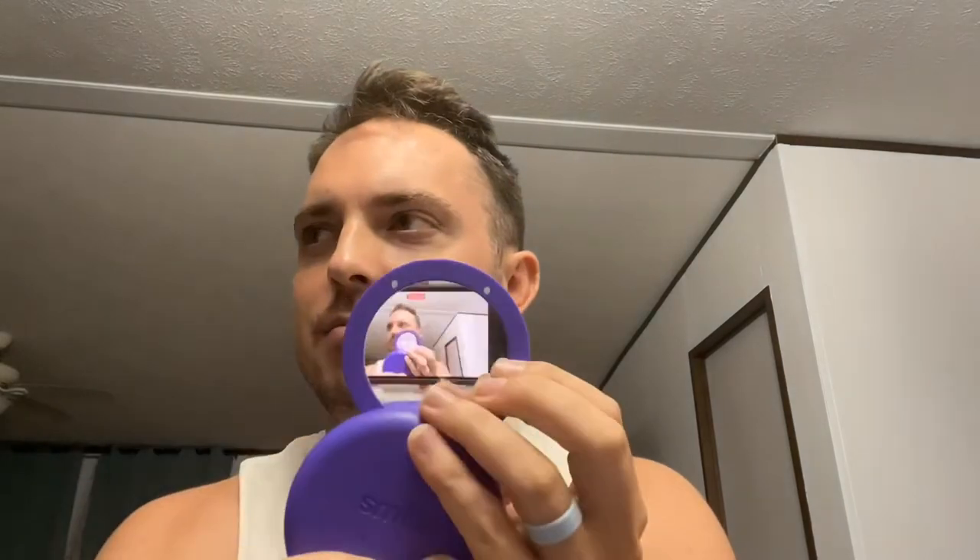I used my little tooth hook for the first time earlier — super convenient, pop it right out. And my little caddy — I finally looked at the directions and found out that not only is it a little case but on the bottom it has a little rotary mirror. So I did my makeup and my teeth at the same time.